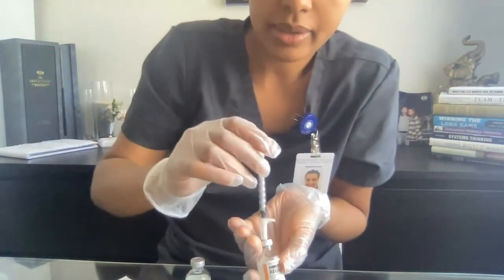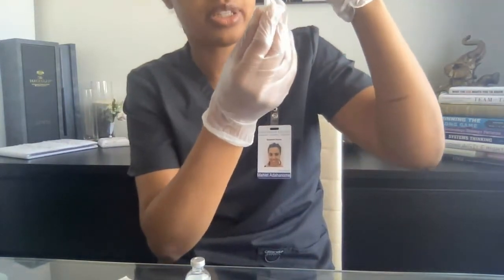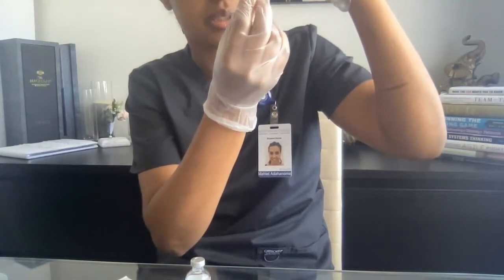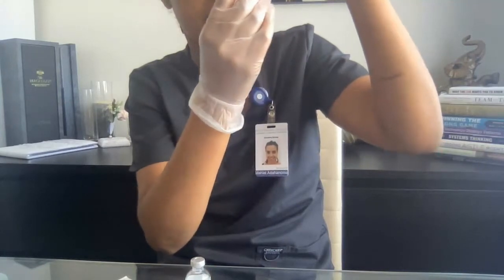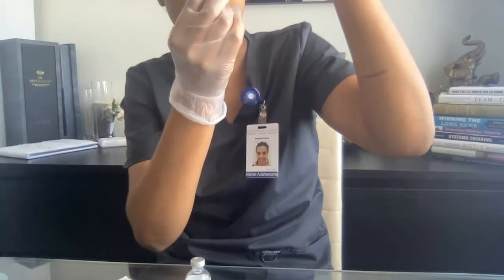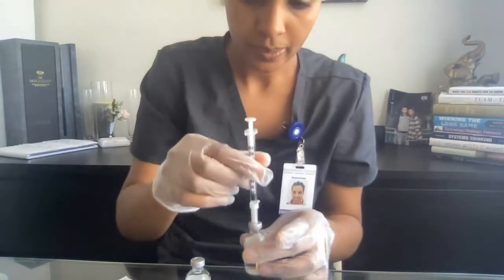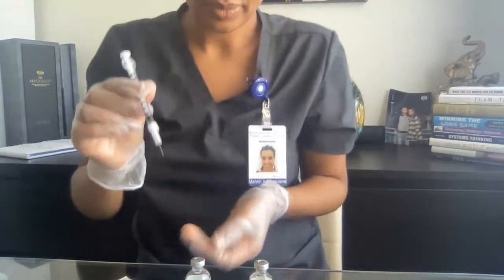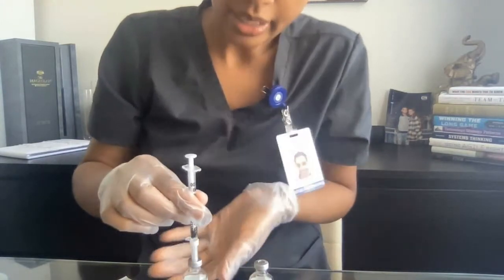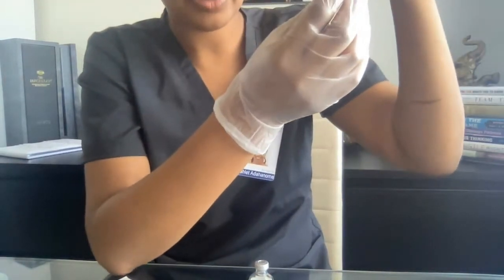Now I'm going to flip this up and draw my 4 units of regular insulin. Make sure you're precise about that. Okay, make sure there is no bubble. Now I'm going to do the same thing and draw up the 8, for a total of 12.